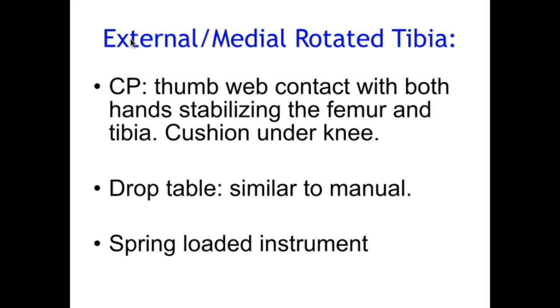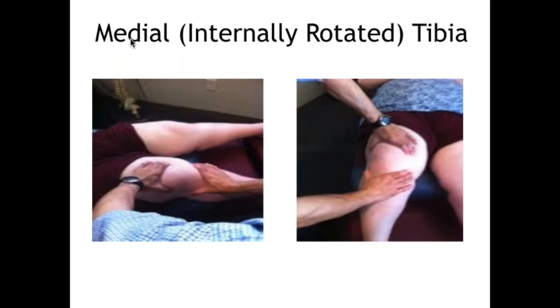Or you can use the activator. And when you use the activator, again, what you're doing here is you are just trying to open up the medial joint line, trying to help to untwist the knee bones, all right?